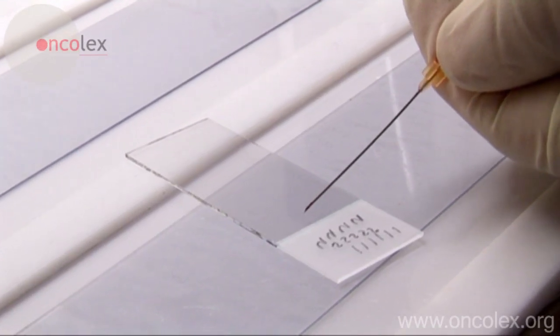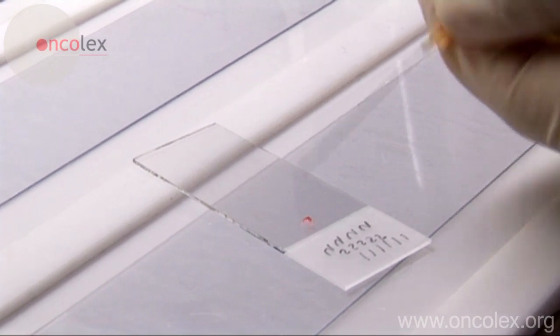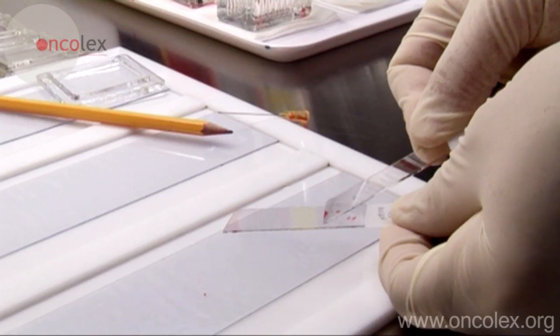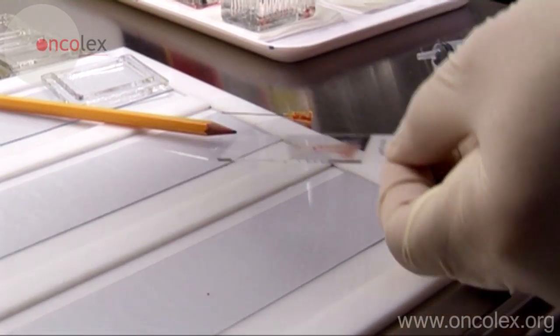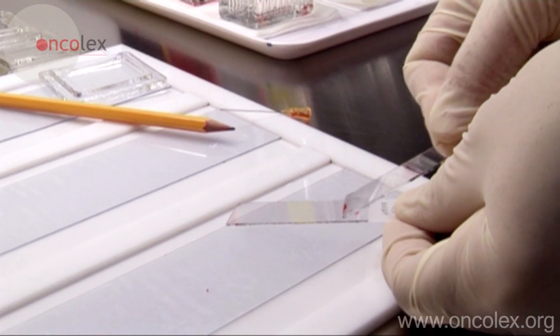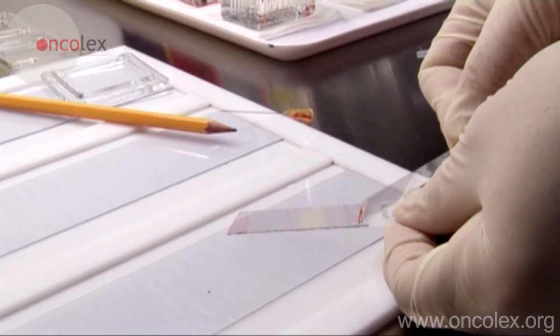After the biopsy is taken, a syringe is attached to the needle and the material is carefully pressed out onto a slide. Another slide is used to smear the material. The material is collected with the slide and then smeared with one rapid, forthright movement.